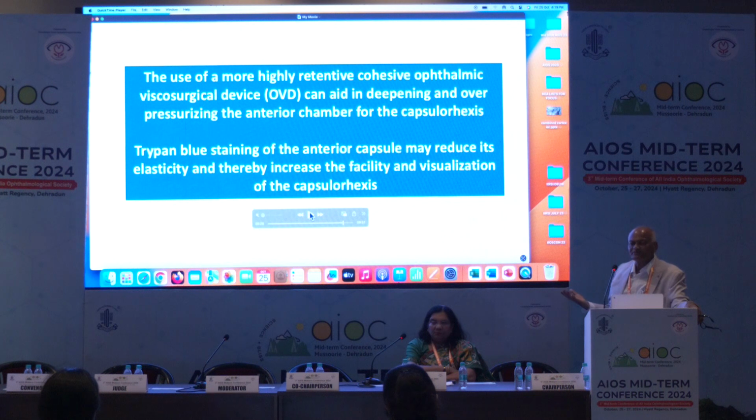If trypan blue is to be used, what are its properties? Can anybody tell me? Trypan blue stains the capsule in 13 to 17 seconds. Trypan blue weakens the capsule in 55 to 65 seconds, not minutes, seconds.